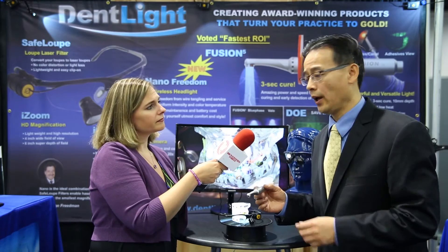Let's start with the Fusion 5. This looks like a really spectacular piece of equipment. Tell us about it. Fusion 5 is a big advancement since our last launch of the Fusion 4. It's all solid metal, really high power. Its three-second cure is 4,000 milliwatt per square centimeter power and it's focused as much as 10 millimeters deep.